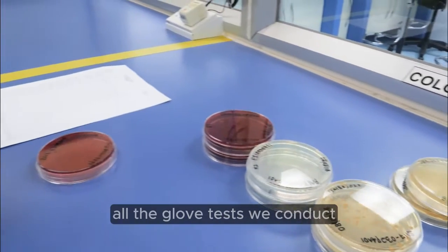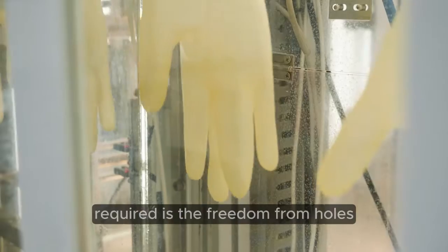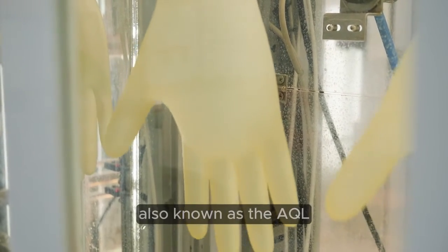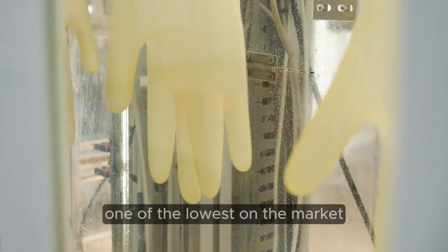All the glove tests we conduct ensure Biogel complies with or exceeds international standards. One of these industry tests required is the freedom from holes, which is determined based on acceptable quality level, also known as the AQL. The Biogel range has an AQL of 0.65, one of the lowest on the market.